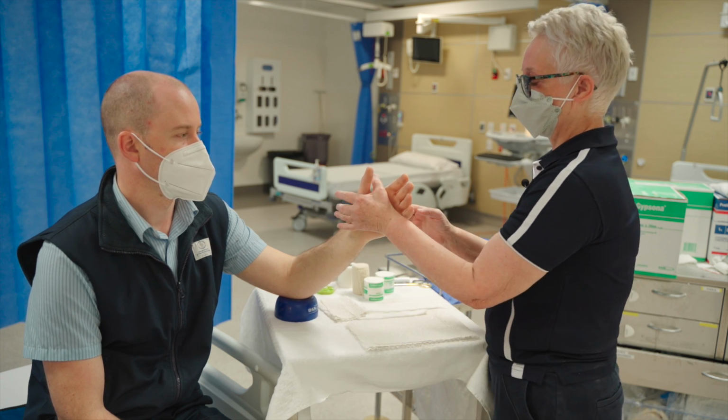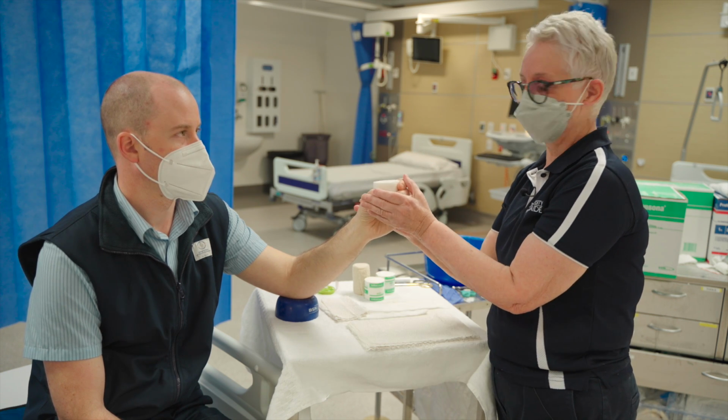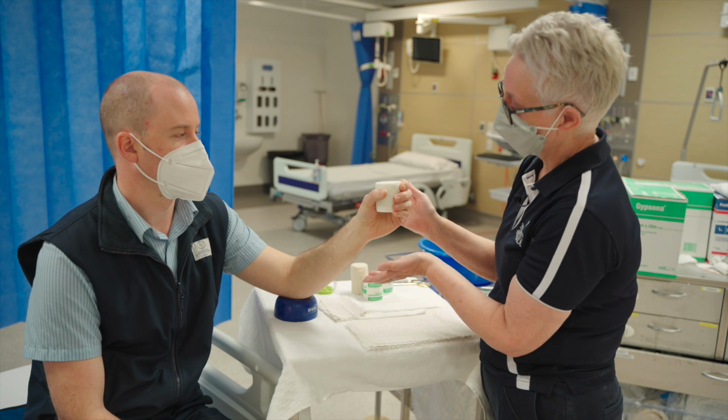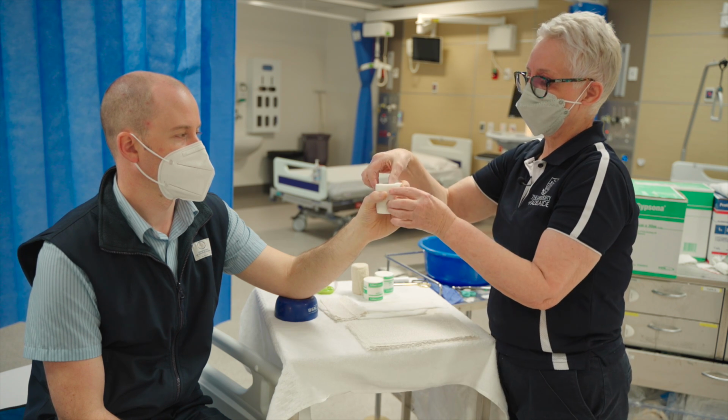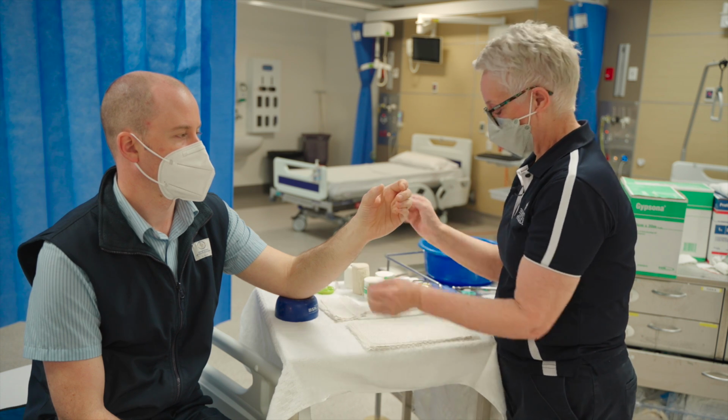So once we've made sure that the skin is all intact, we then pop our patient into position. So the position we want for that, you can take a roll and pop it into the hand. It's like holding a can of drink. So we hold the hand like so, and then we slide that out gently, and that's our position there. So that's where we try to keep the patient.